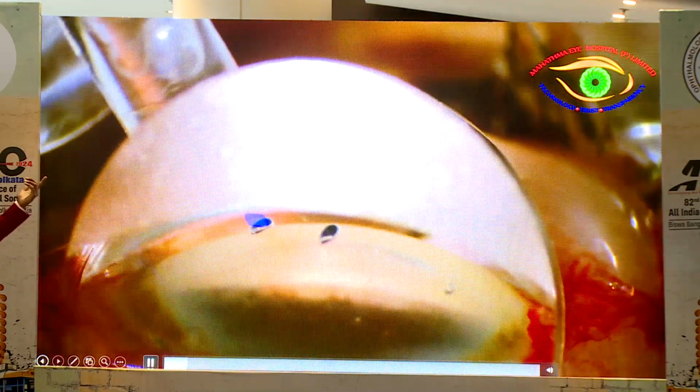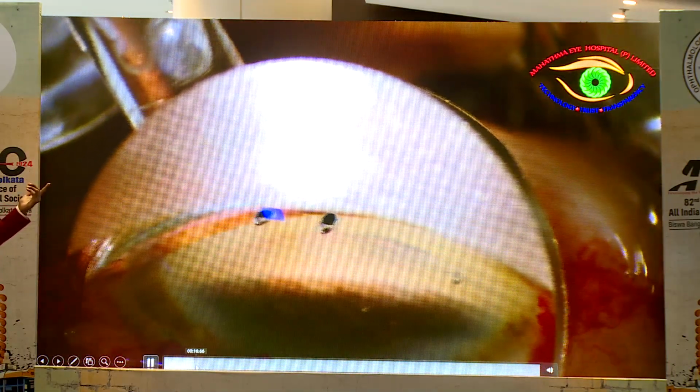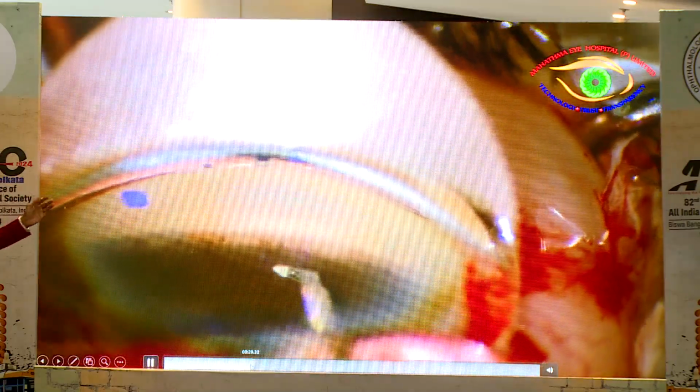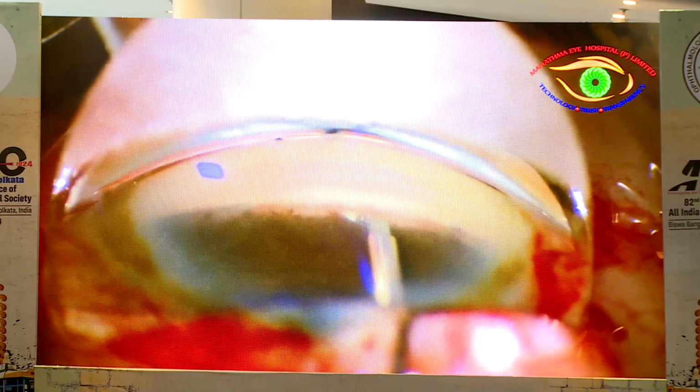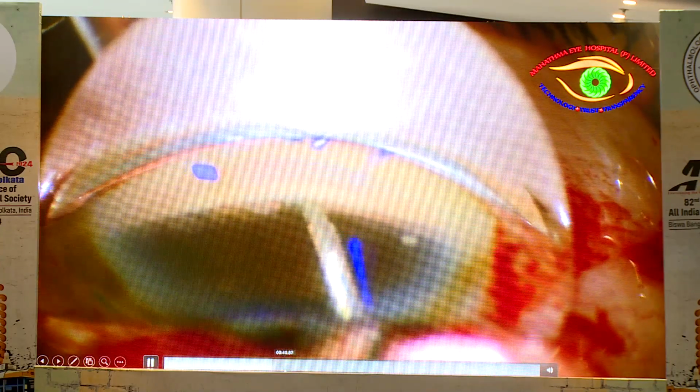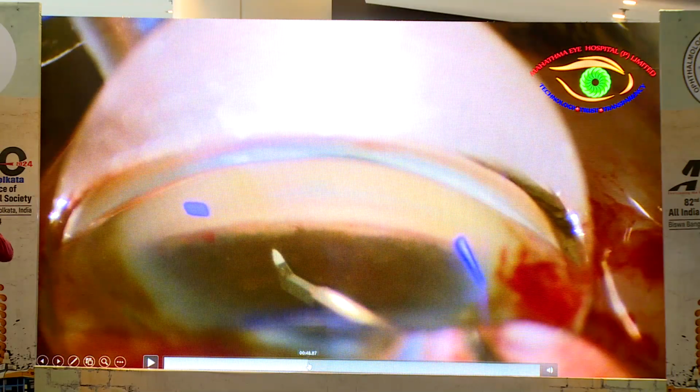And then there you can see a direct gonioscopy here followed by the KDB. So in this we can see the blade is made for this. It's a dual blade called the Kahook dual blade. So this is upcoming in the glaucoma sector. I just wanted to show the procedure for the neophyte so that what we are going to talk on is going to make a lot of sense.